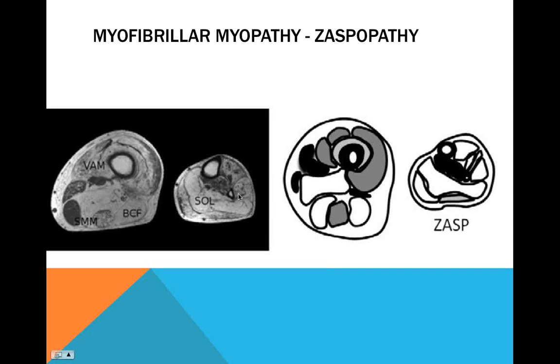So basically, here at the NIH, we can do MRIs under sedation if it's helpful for a diagnostic workup in someone who's undiagnosed. Sure, we do plenty of our MRIs under sedation. But so long as they have a diagnosis, we are not allowed to sedate them. So if they already have a genetic diagnosis, we can't. Exactly. They say that the risk does not outweigh the benefit.